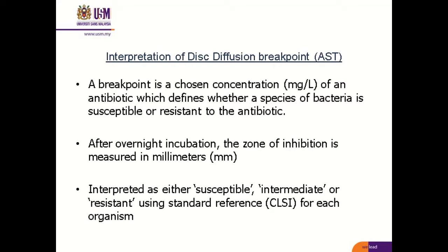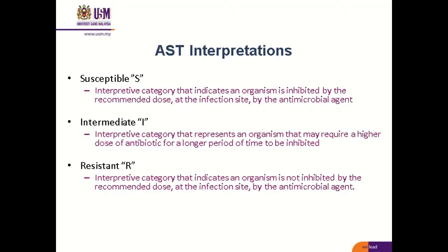After overnight incubation, the zone of inhibition is measured in millimeters and interpreted as susceptible, intermediate, or resistant using the standard reference given by the CLSI, which is an international body which gives guidelines for interpretation of this antibiotic susceptibility test. This guideline is updated almost yearly and provided to the lab by CLSI.